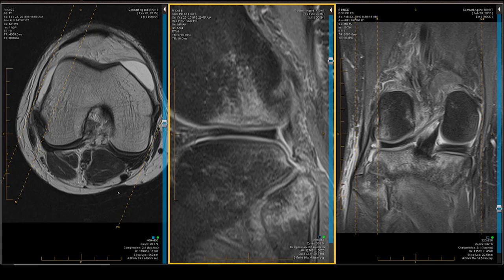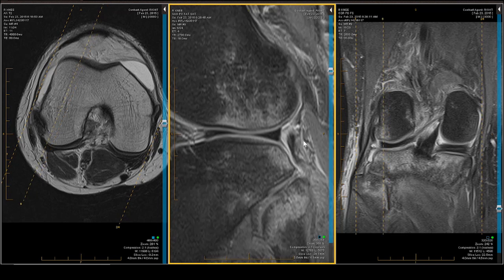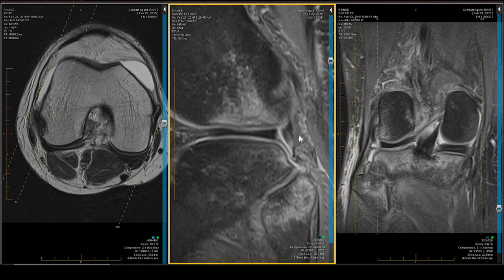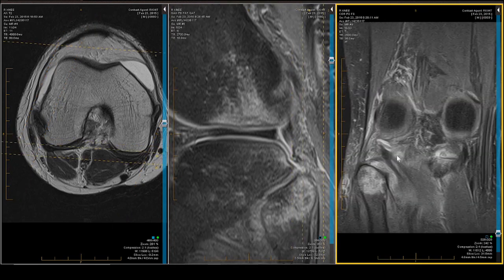We have a popliteofibular ligament rupture — certainly a high-grade tear. Now, what's behind the popliteus tendon? The arcuate. It is a glorious mess. This would be the arcuate space right here — it looks a little more linear on this cut, but on the very next cut as we go more peripherally, it turns into a bag of blood and stressed-out, torn, coiled arcuate complex.